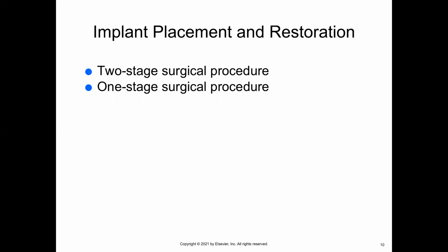Combined with a scan of the arch where the implant is going to be placed, a surgical guide can be fabricated. This allows the doctor to put the implant exactly where it is supposed to go with minimal errors, giving the implant a longer survival rate.